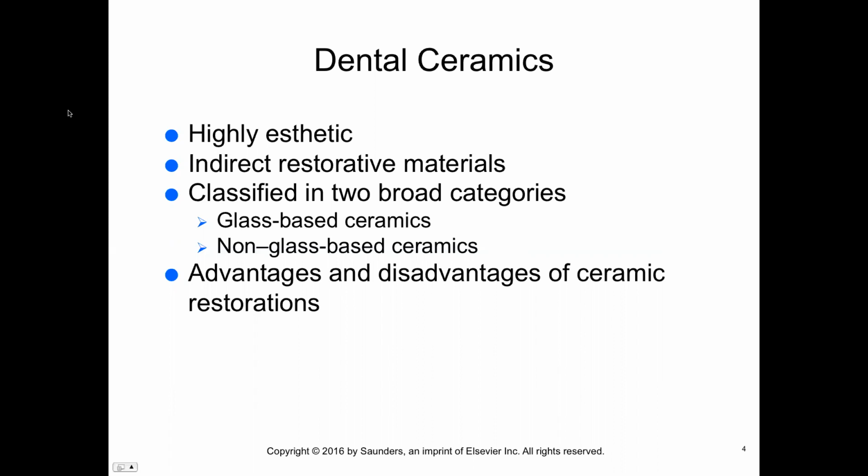The primary advantage of ceramic restorations is their aesthetics. Other advantages include their biocompatibility, wear resistance under function, stain resistance, and the ability to precisely place contacts and contours of the restoration. Some disadvantages of ceramic restorations include their brittleness, their wear of the opposing enamel or restorations, difficulty or inability to repair them in the mouth, the need for 2 appointments, and also the difficulty of polishing them in the mouth.